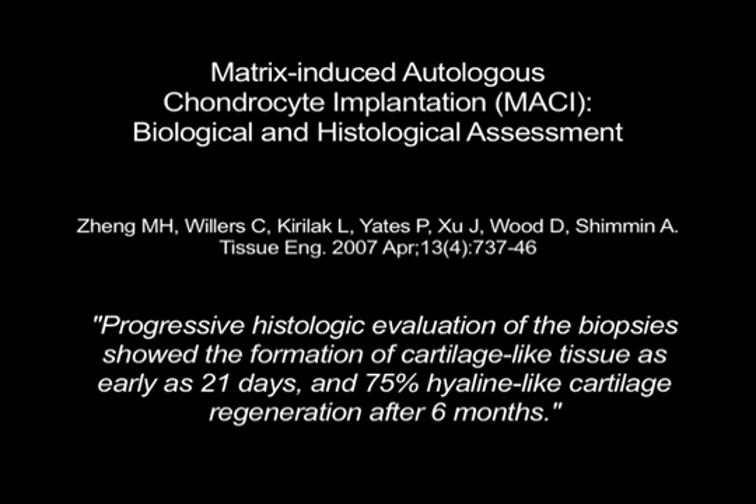It's an evolution of the work initially pioneered by Britberg and Peterson in the 1990s. Subsequent work done by Professor Zing demonstrated that chondrocytes could avidly bind and indeed migrate through fibrin glue.